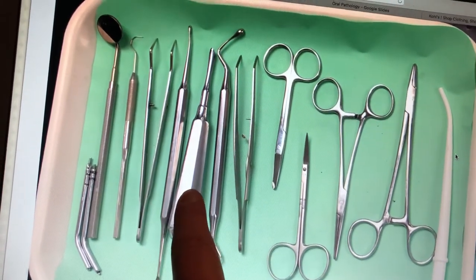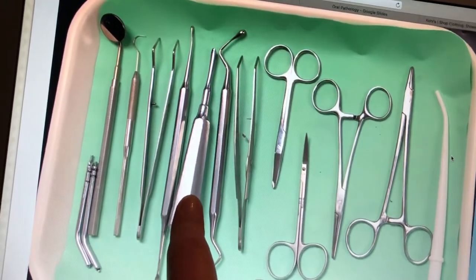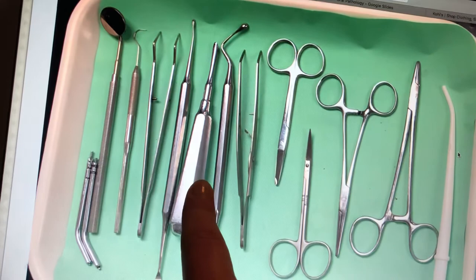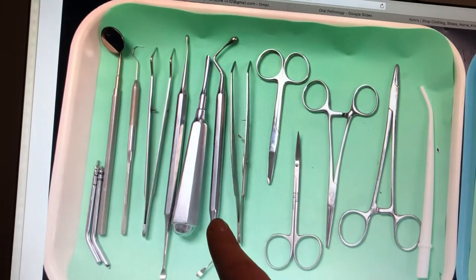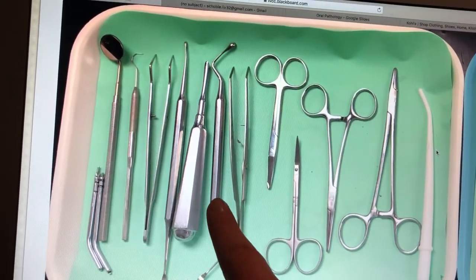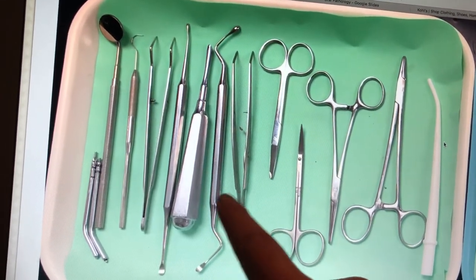This one is going to be the luxating straight elevator — it's kind of hard to tell which one that is — but it's going to be used to cut the periodontal ligaments and then to rock the tooth back and forth to get it out. This is going to be the surgical curette, and that's going to be used to remove any debris, or if there's a cyst in the site, it's going to be used to remove it.